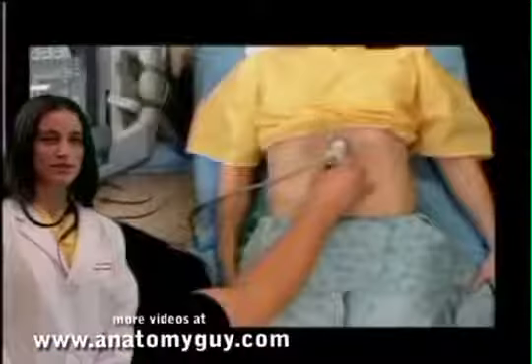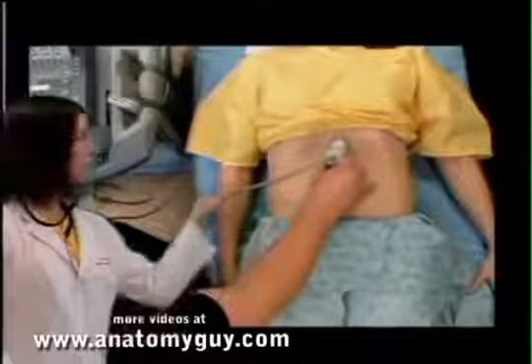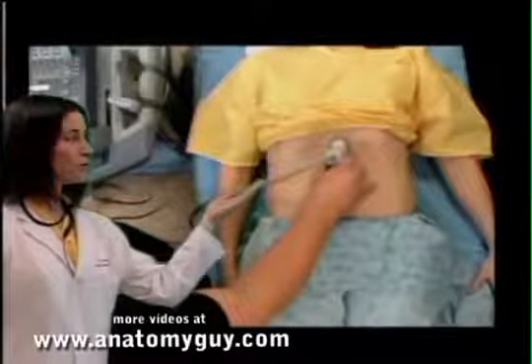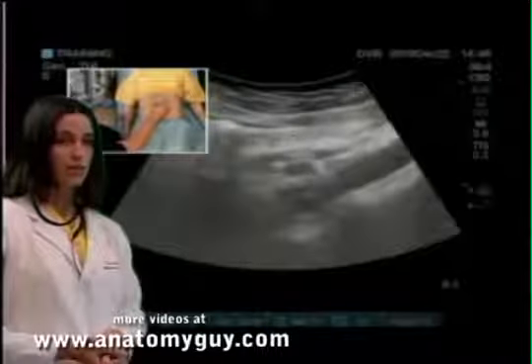Let's go back to the ultrasound table so we can look at some of these in a clinical scan. To scan the abdominal aorta, we first start with the probe marker positioned up towards the patient's head. The probe is going to be positioned just to the patient's left of the umbilicus, a little left of midline. And next we show what we see on our bedside ultrasound screen.